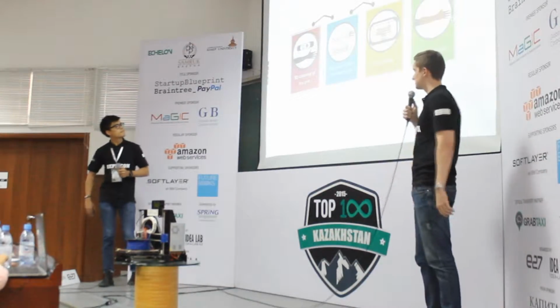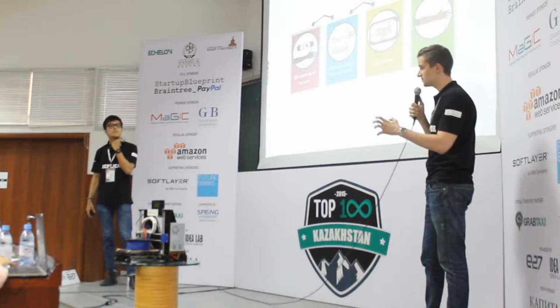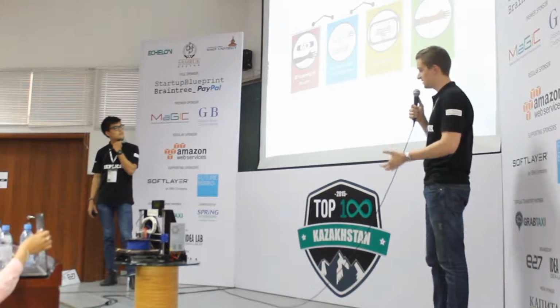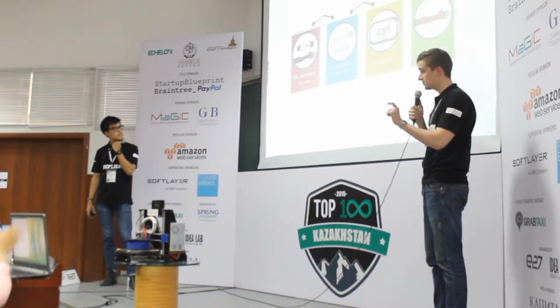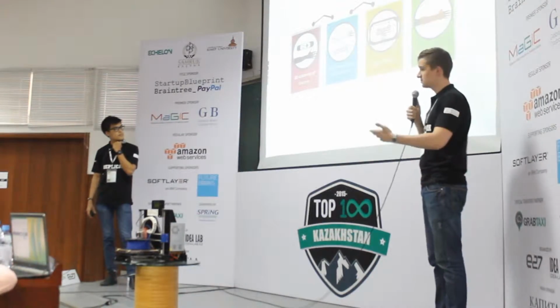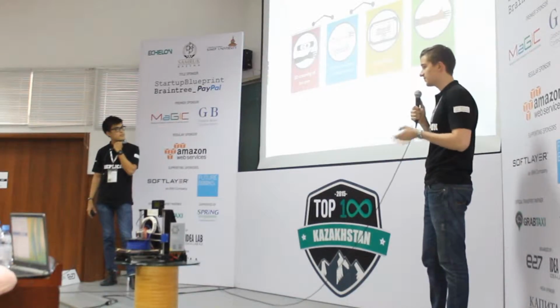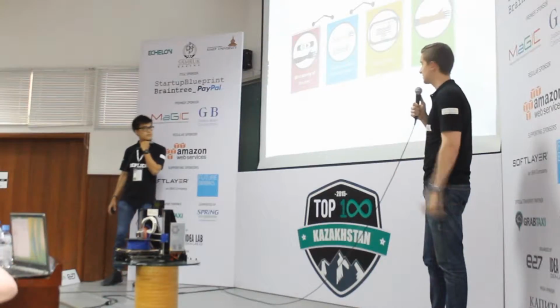So here you can see the technology for top fixation. First of all, the surgeon makes a 3D scan of the patient. Then he adjusts the dimensions of the 3D model of the future cast, and then he prints it. And then the person gets this original printed cast. Also, we developed a technology for needle fixation on the next slide.